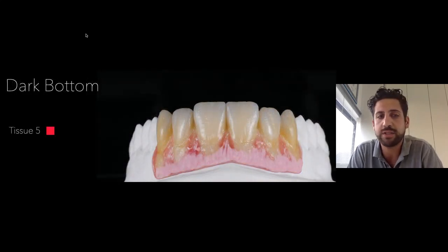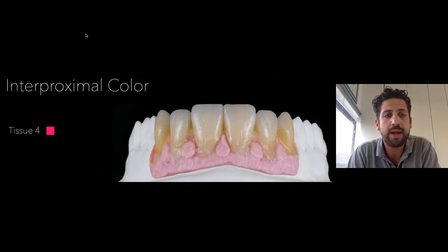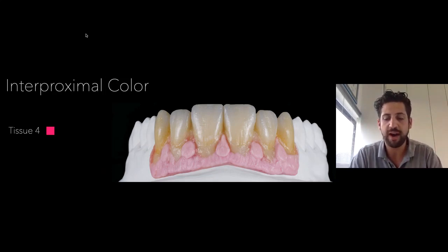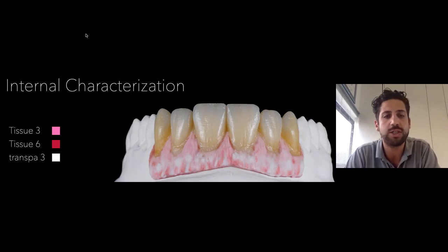And now we start with the first layering. We start with tissue 5 to make the dark bottom, just in the deep side. Then we continue with number 4 to make the passage between the light color and the dark color tissue 5. And then we also make the internal characterization with tissue 3. Tissue 3 is an opaque tissue. Tissue 6 is like a violet, and transparent 3 is a kind of white. This is to make the internal characterization of the gingiva.